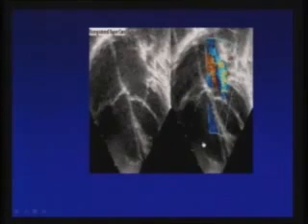Okay, in continuation with the sequential analysis, we have discussed AV concordance connection, how to define the right atrial, left atrial, right ventricle, left ventricle. Just continuing, here we are seeing a patient of situs solitus with AV discordance. By seeing this view, you cannot use the term corrected TGA or the LTGA. Definitely you have to ask about the situs.